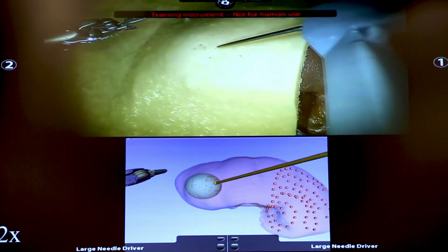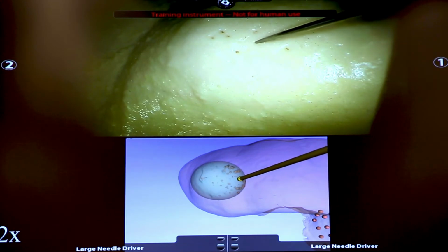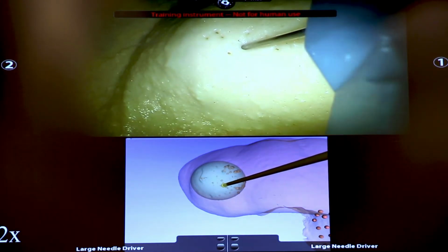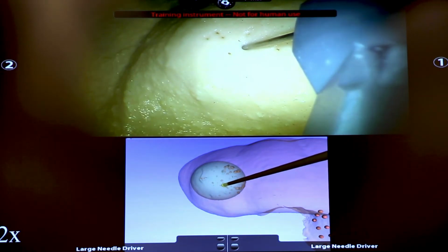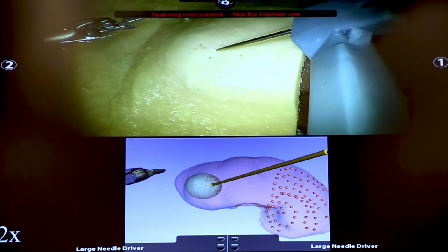The next thing that we did to qualitatively assess the usefulness of this for localizing these subsurface features was to have the surgeons place needles into the tumor through the fat, so you can see that here.